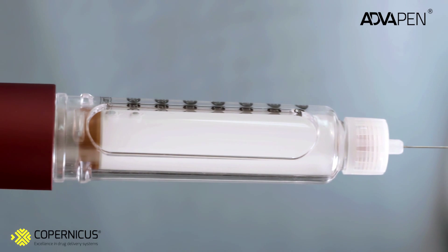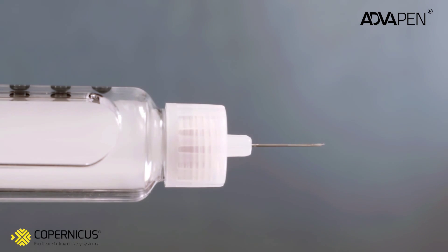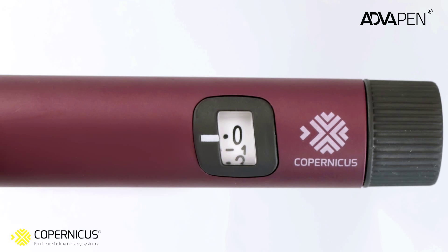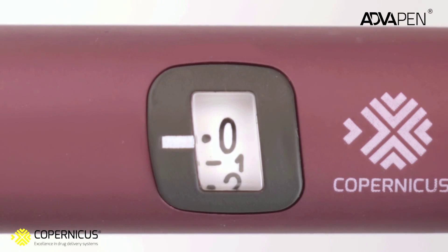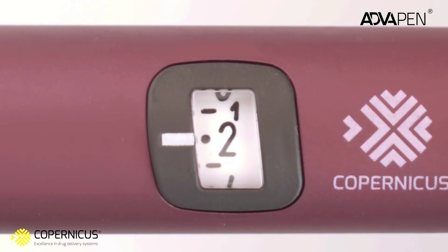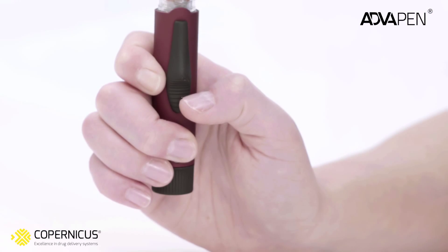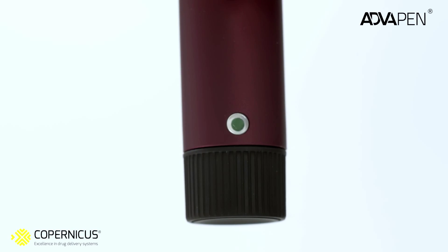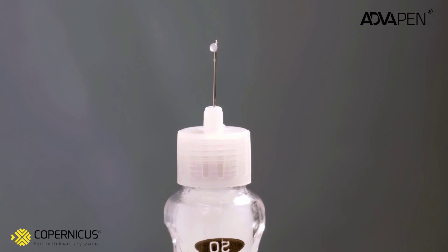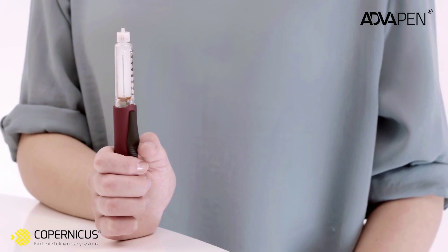Before performing an injection, you must always prime your pen. Priming is necessary to remove any air from the cartridge and needle tube. Using the dose selector, choose 2 test units of insulin by turning the dose selector clockwise until the figure 2 appears. Hold the pen with the needle facing upwards and using your thumb, slide the trigger in the direction of the needle. Hold the trigger until a green dot appears in the window, signaling the end of injection. You should see a drop of insulin at the tip of the needle. If a drop does not appear, dial 2 units again and prime once more with the needle facing upwards.